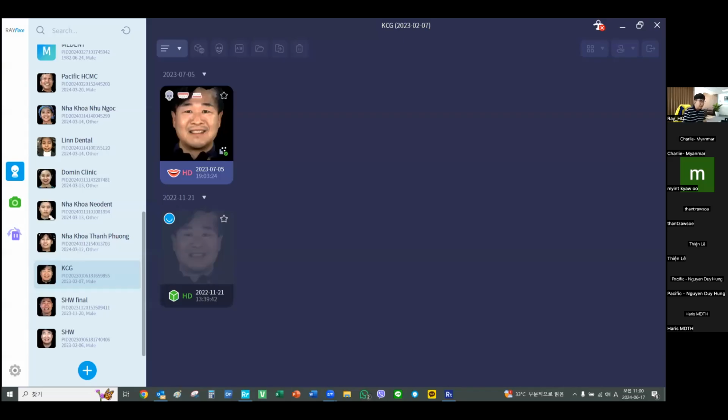A little bit of the clinical applications. So about how to take the photo, it's quite easy, and you can find it on YouTube or any kind of video. So you can find it.